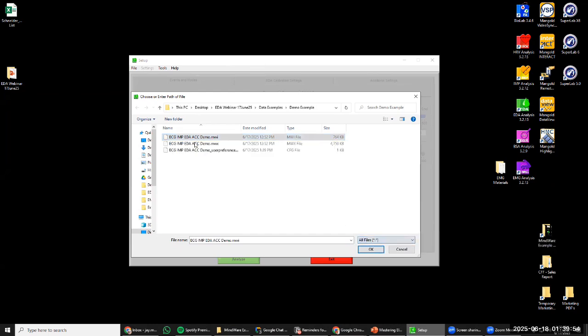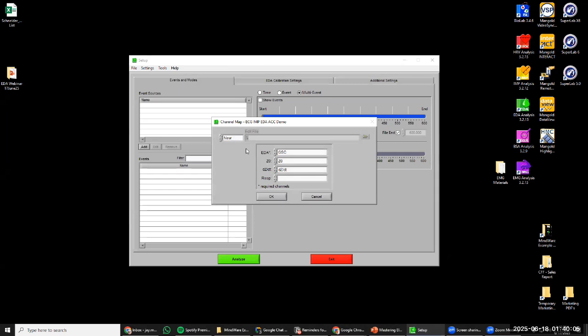If I turn this off, we can actually see the MWX is present in the folder. Again, that's the raw data, but we just don't actually load it. So anyways, we're going to load that MWI file. And we haven't made any edits to our file, so we're going to leave that on new. And then as far as the channel mapping, we're going to just go across and highlight at the very minimum the required channels for this measure.